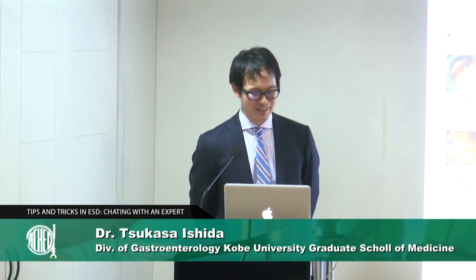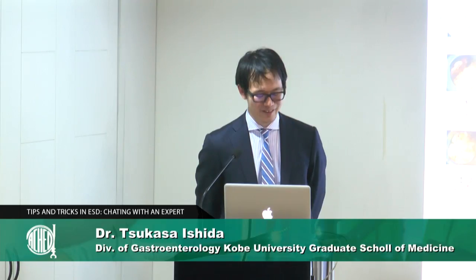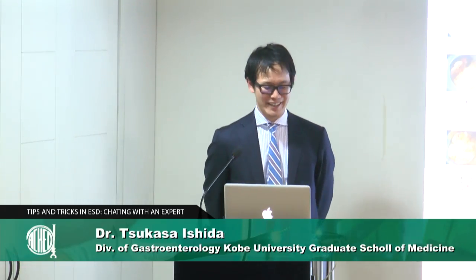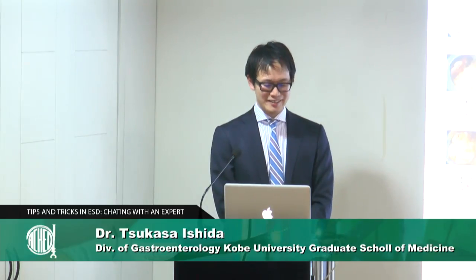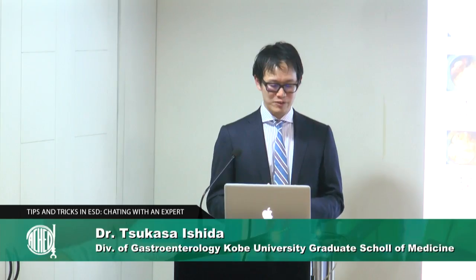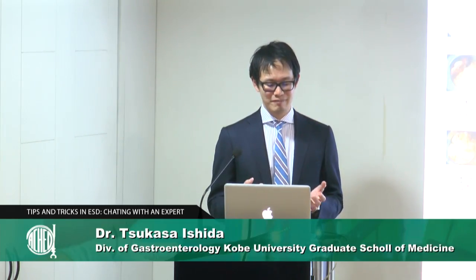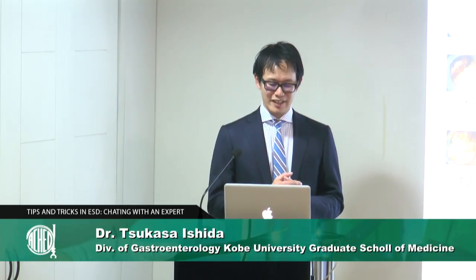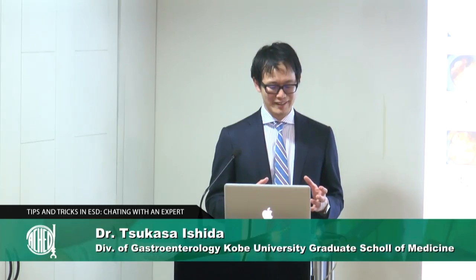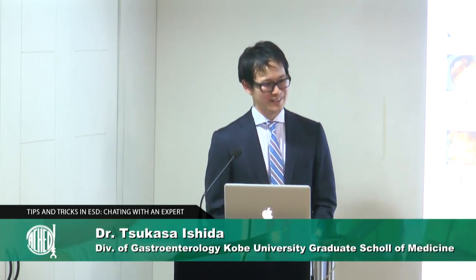We want to resect by EMR. Especially our facility, I hope to resect by EMR. Before, the indication of the EMR was more wide, but now the indication of the EMR is a little bit narrowed down.